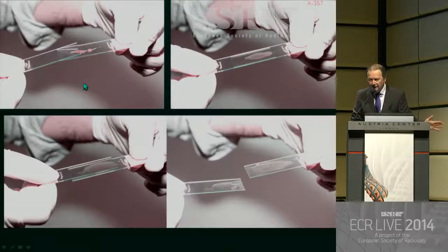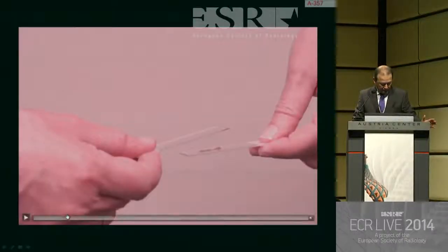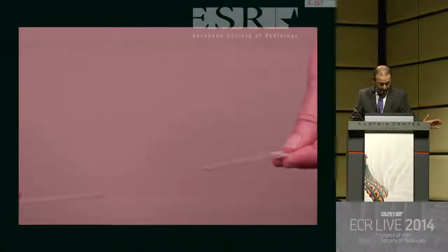And then in that case, I don't need to do the 3 passes. This is an important step. Just to know how to smear the specimen, you have to do it in a soft way, not to smash the cells. This is an important step.